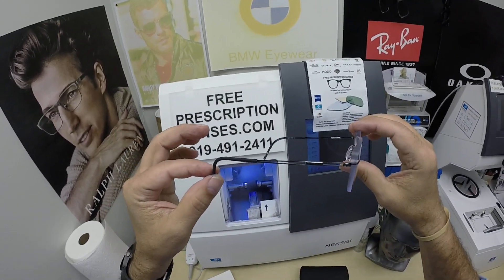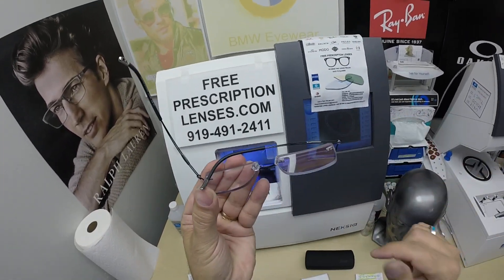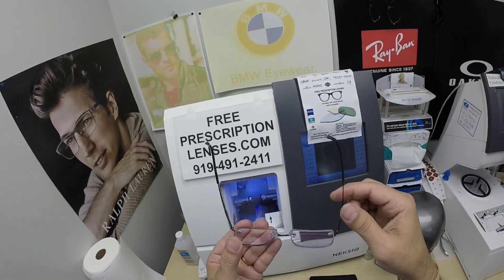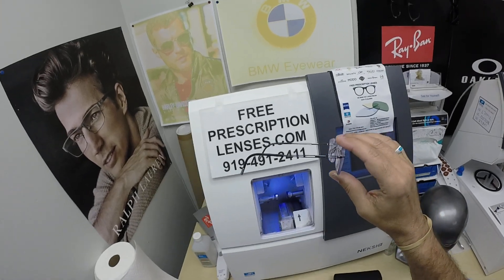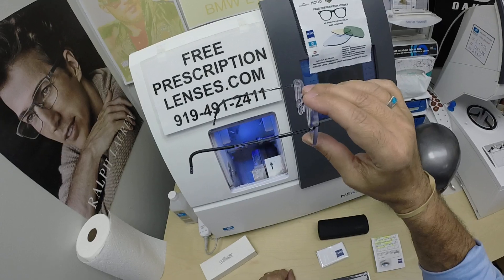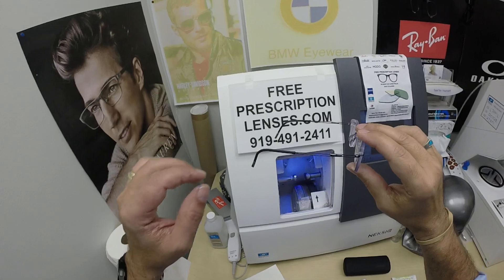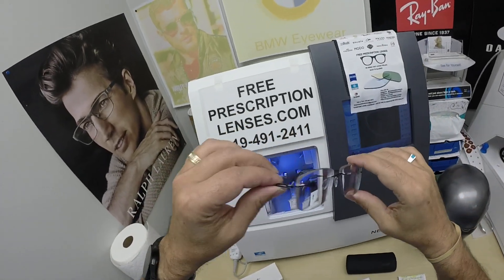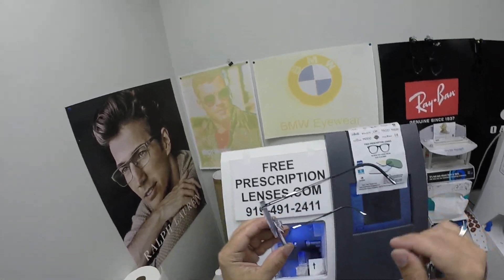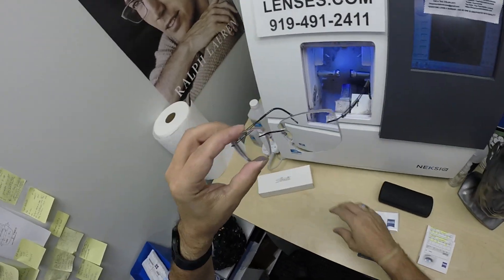Now Silhouette — I apologize, I should have had another frame ready — but this is the traditional hinge, meaning it has a traditional hinge. They do have a memory metal frame that you can spring back and forth and it returns to its original shape. That's the memory metal titanium. This is the traditional titanium. They're all titanium. They're all made in Austria.